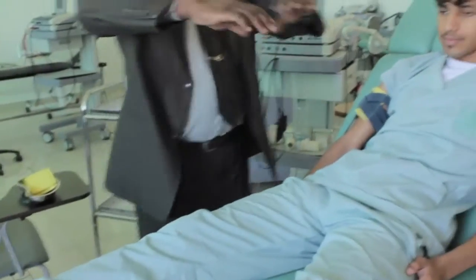So patient position can be sitting like this, supported or supine, or you can sit on the chair and keep the arm in a supported position. Whatever is comfortable for the patient, you can keep in that particular position, no problem.